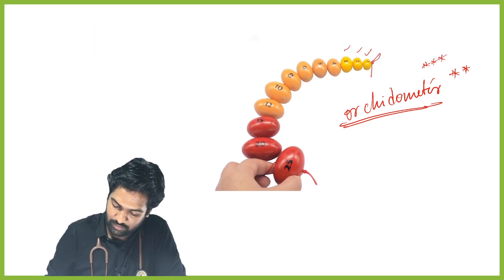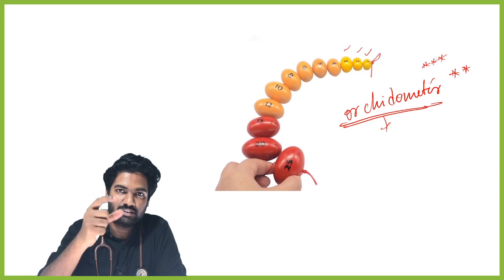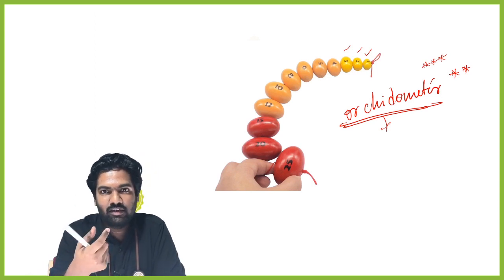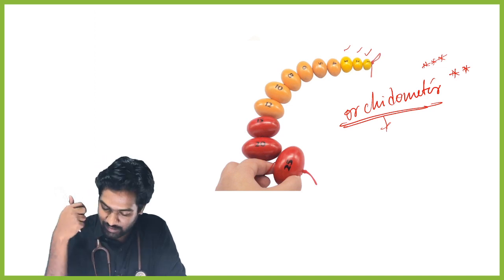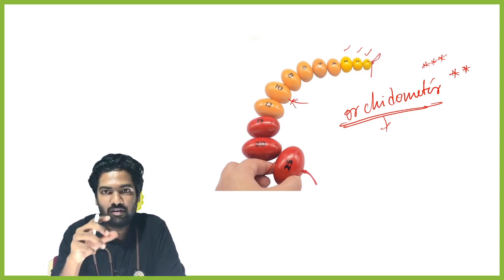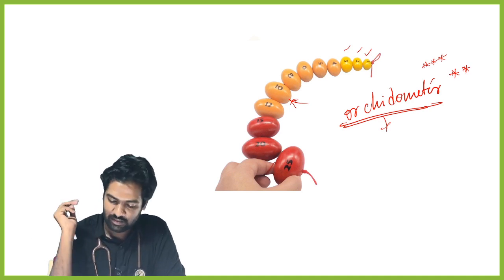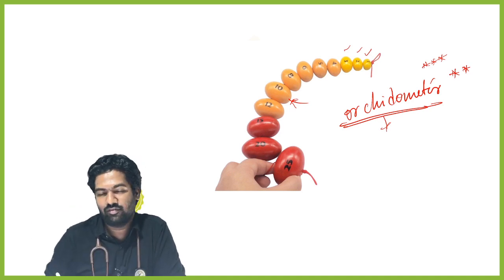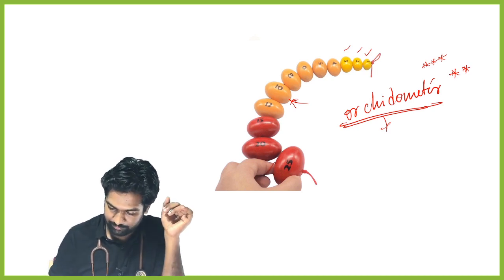Based on this orchidometer, in Tanner staging they don't consider just the growth of the testis, they consider the testicular volume, and that is where this comes into play. For example, here it is 10, so it means 10 ml, the volume we want to tell at this stage. So read Tanner staging. That is the question they might ask if you get this. Okay, let's go ahead.